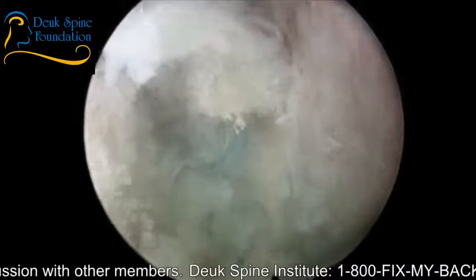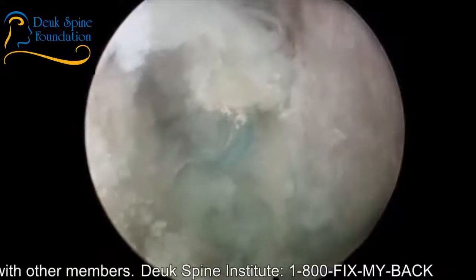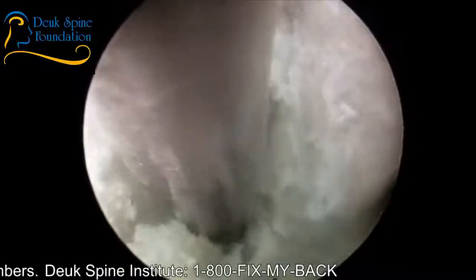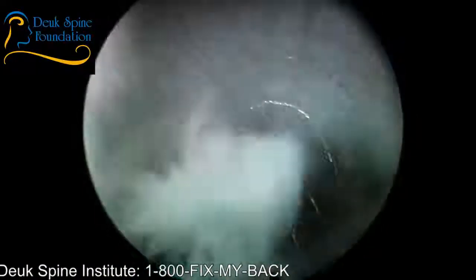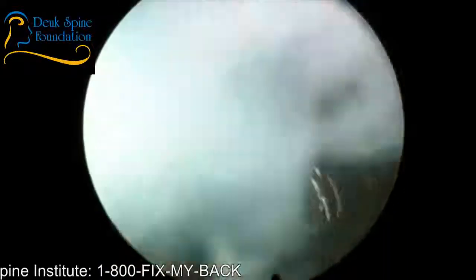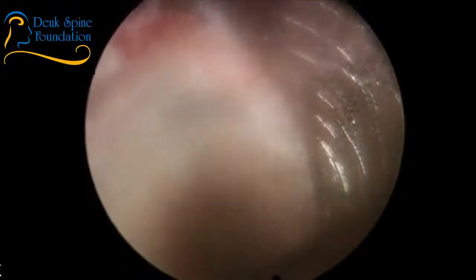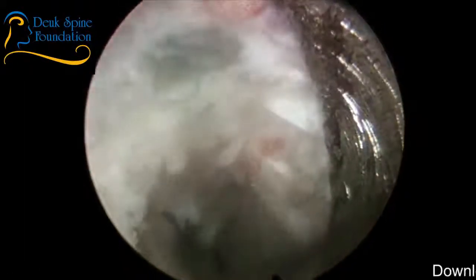Well, we are just about done with this disc. And there's a piece of herniation right there. Just came out. Let's see if I can grab it. It's misbehaving. Come on out. You can wipe. Nice.